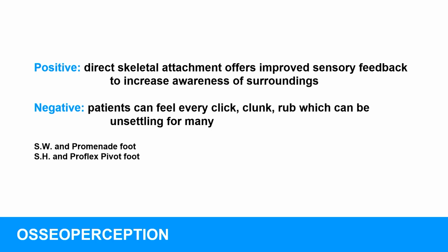That's different for every person, but the direct skeletal attachment offers improved sensory feedback to increase the awareness of surroundings. But you can also hear the click of a microprocessor knee. You can hear the click of a DuraShock that's going out. So the negatives are that the patient can feel every click, clunk, and rub, and the disadvantage is the first thing the patients think of is, is that my implant? And that's a very anxious feeling.